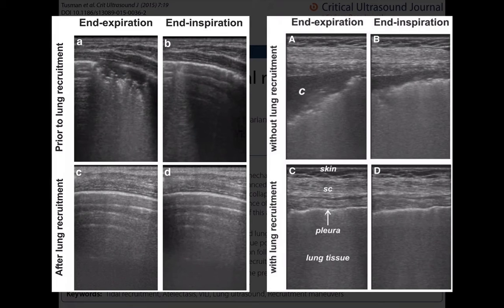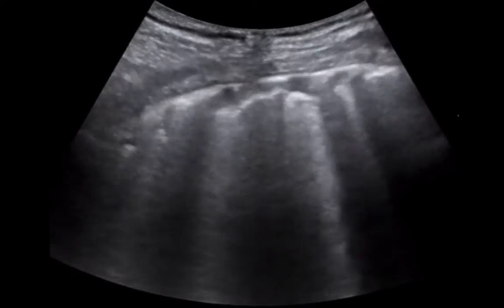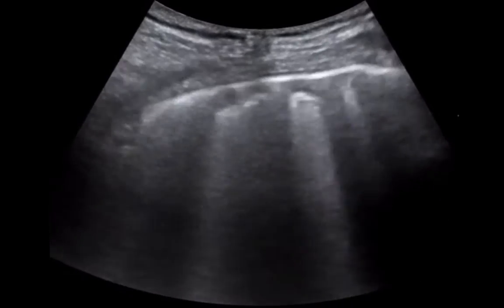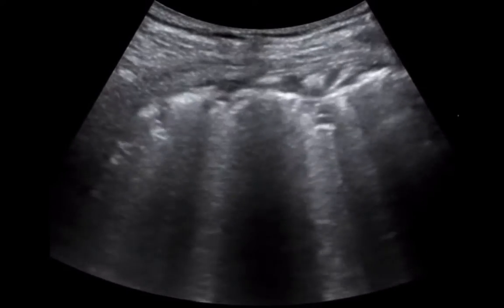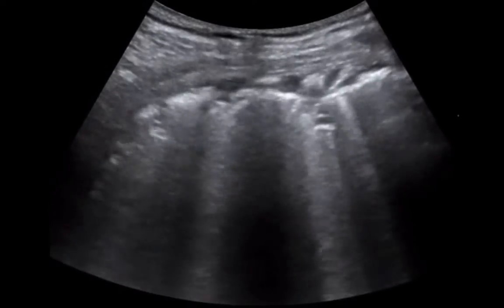Okay. All right. So what do you think of this guy right here? What does this kind of look like? Looks like atelectasis a little bit, right? Kind of like what we were seeing before. Yeah, that's pretty interesting. Let me tell you this guy's story. This was a stoic, very healthy Kentuckian that was healthy because he'd never really gone to the doctor before. So he didn't have anything diagnosed.